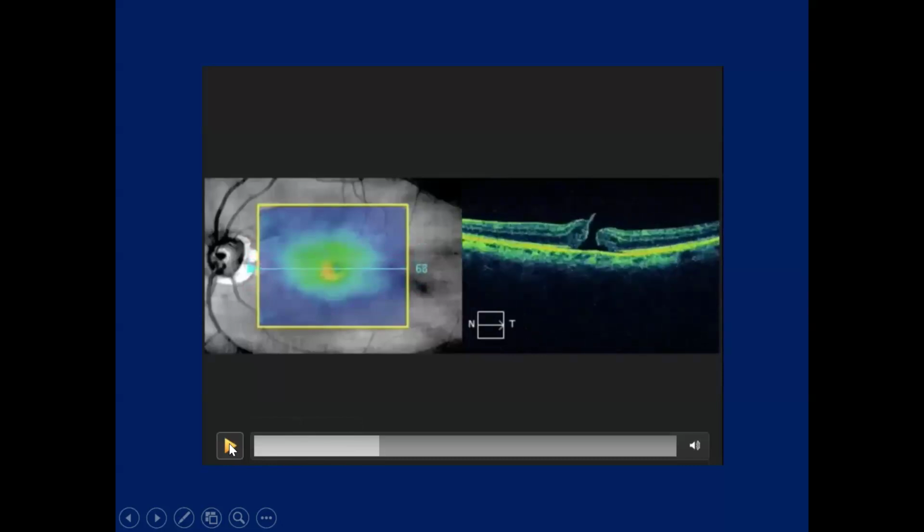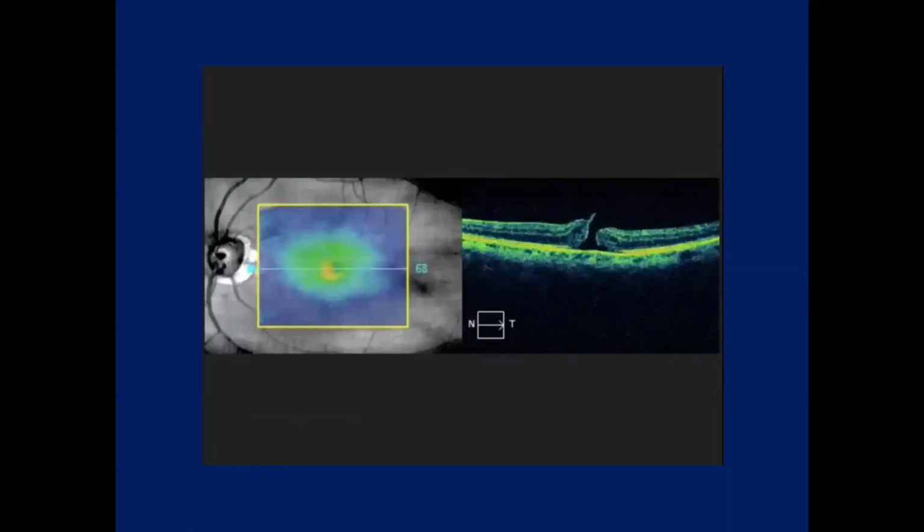Have you seen now? Then it's a macular hole. So what I will recommend for any one of us who has a chance to practice with OCT: don't rely only on the printout of OCT. Rather, you better go to the OCT machine and try to scan like this.